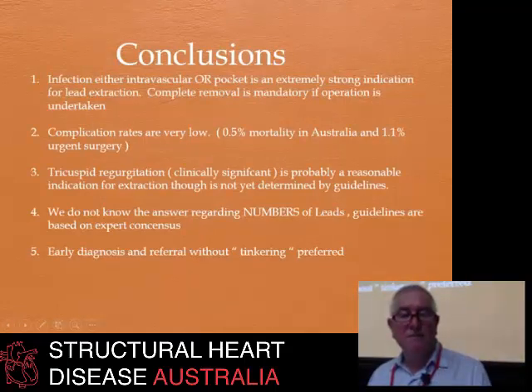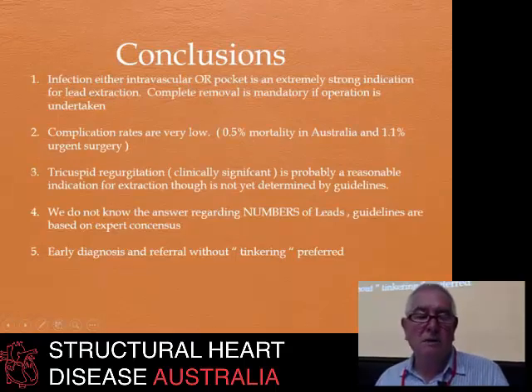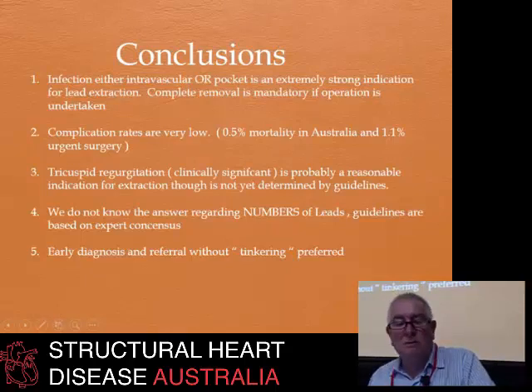Conclusions, therefore. Infection, whether it's intravascular or pocket infection, is an extremely strong indication for lead extraction, and complete removal is mandatory if you hope to cure the patient. Complication rates in Australia are extremely low, and the data has been well collected over many years by the Lead Extraction Committee and been looked at quite seriously, and compared to the overseas rates, this is probably less than half of what's quoted in most areas.